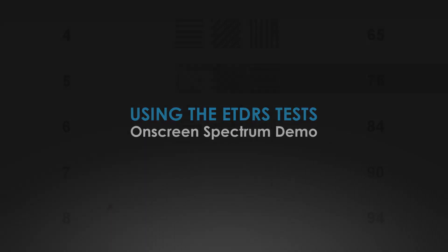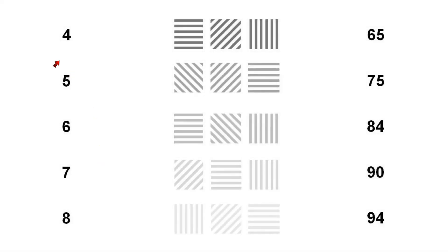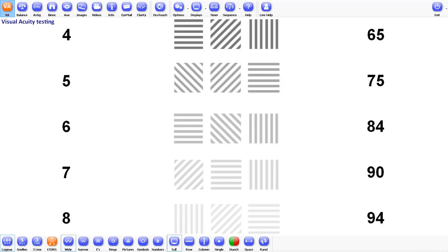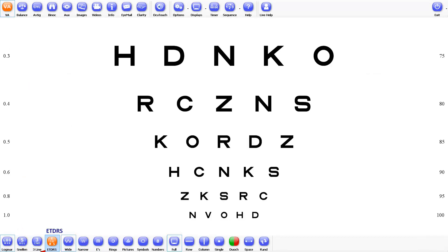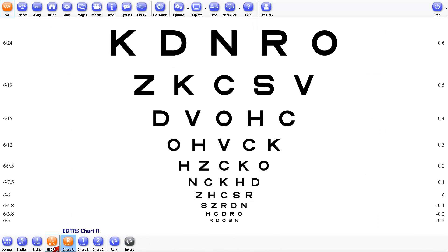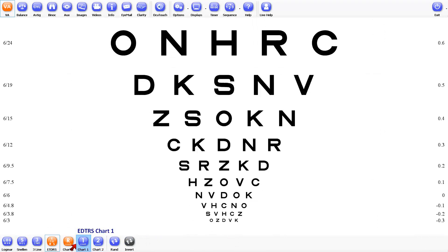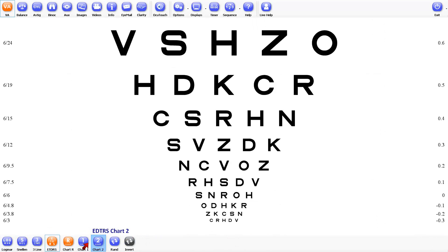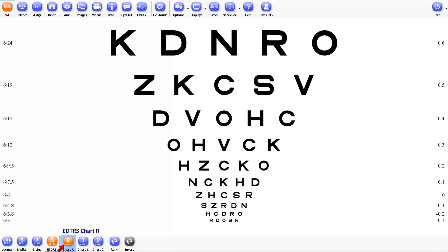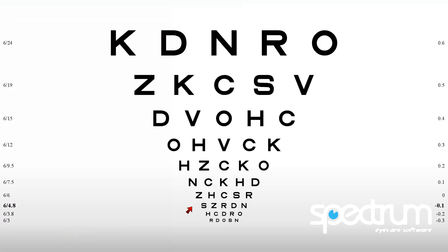So let's have a look at what this looks like and how these tests are done. Select VA from the top toolbar and then ETDRS from the lower toolbar. The Spectrum ETDRS chart R will be displayed as the default. We have included all the ETDRS charts, so you can select chart R, chart 1, or chart 2. The additional chart 1 and chart 2 can be used to avoid patient letter memorization while still maintaining a standard degree of difficulty between the charts.